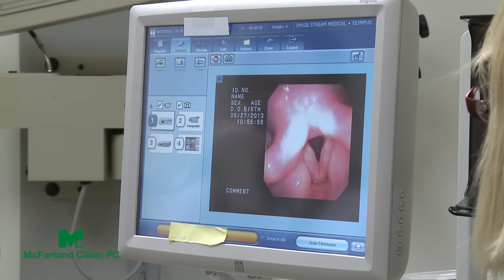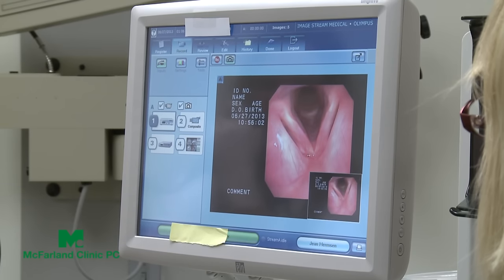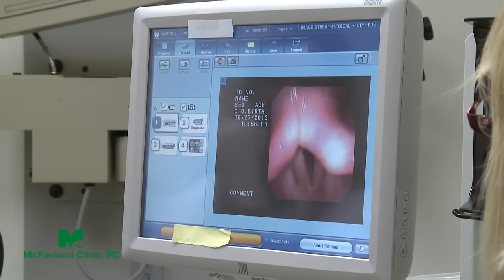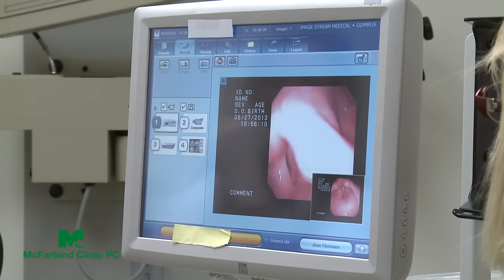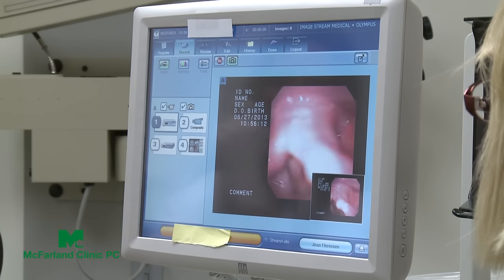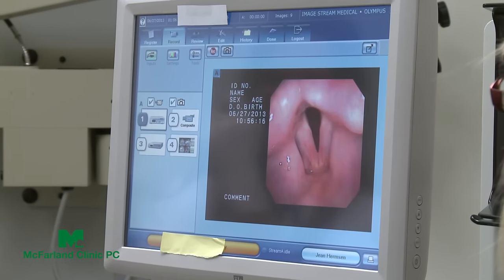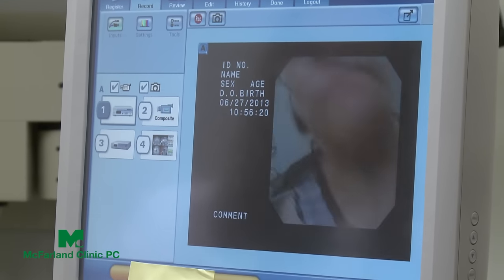All right, now down to your vocal cords. Take a big deep breath in — good. Say 'ee,' and do it for a little bit longer for me. Good. The whole area is definitely looking better. Take a big deep breath in again — good. They do look better.